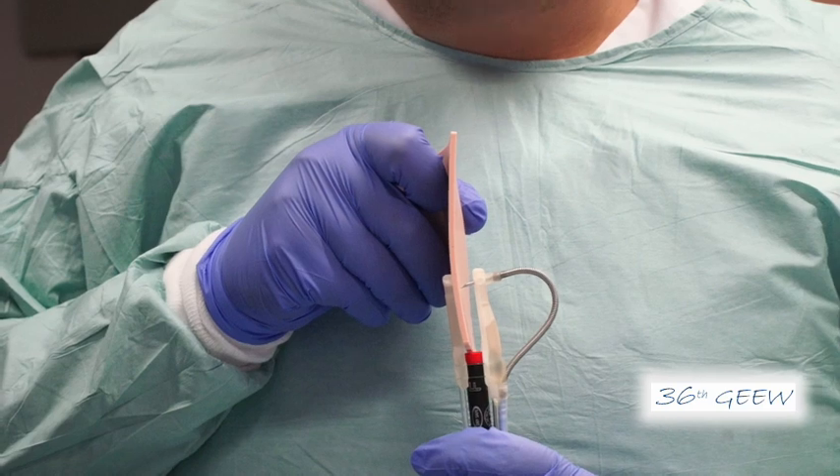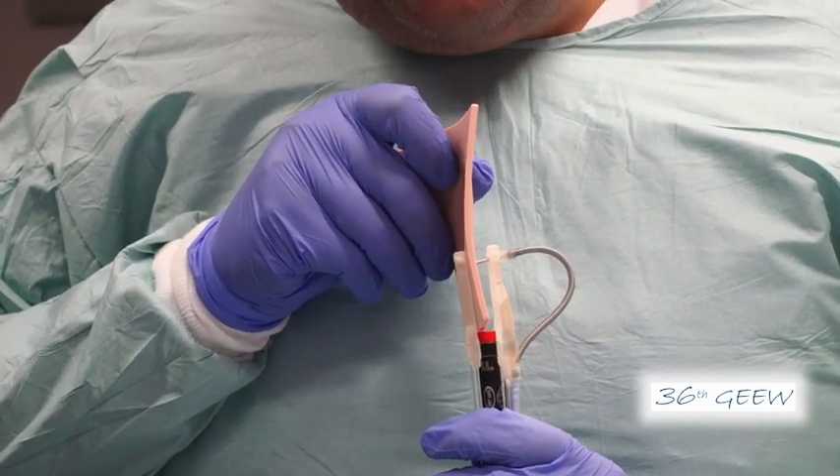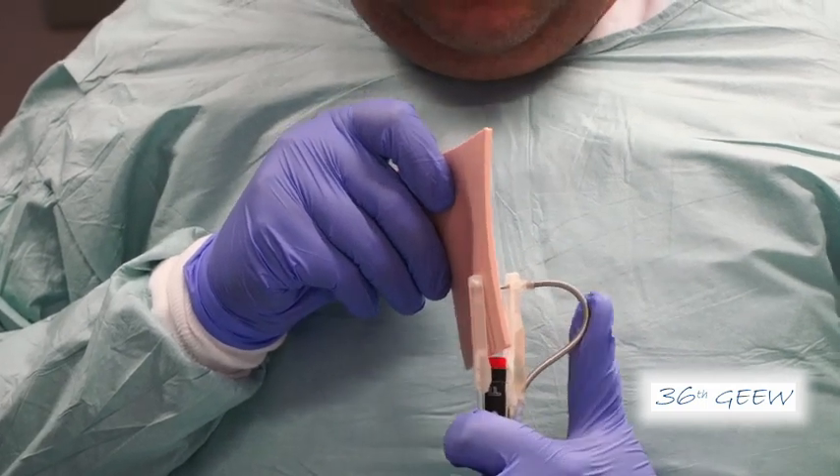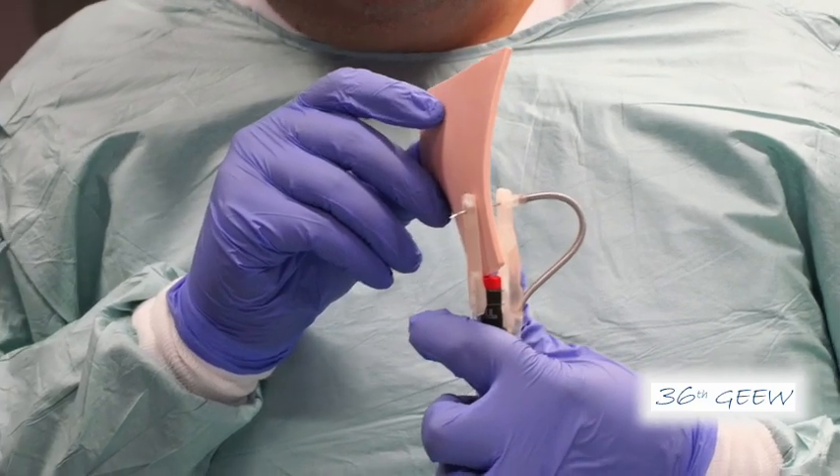You can see now the needle piercing — nice. You have the full thickness piercing, continue. We can see it very nicely; this is really a nice overview. Now we release the first tag — please release the first tag.